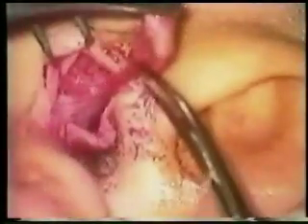The graft will come from the tragus, which is the little tab in front of the ear, and this will not be cosmetically objectionable. In fact, one can't even determine that there's been graft harvested. The cartilage is removed and the area is sewn together, but the dome — the bump in front of the ear — has been maintained.